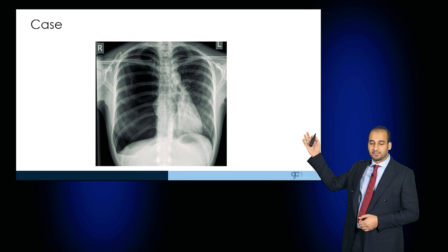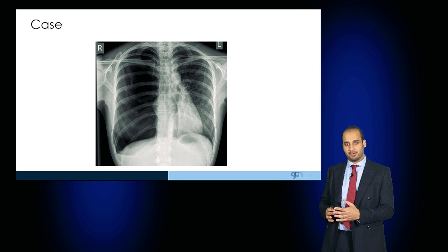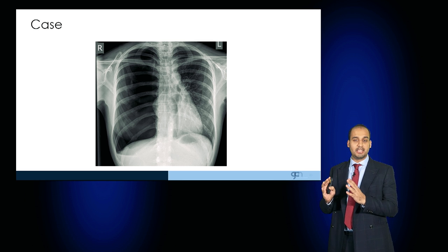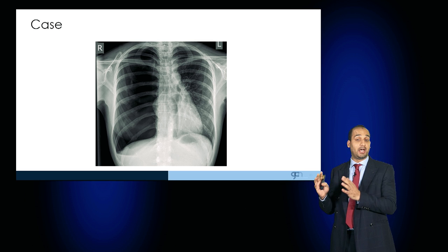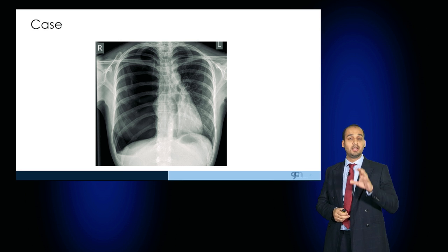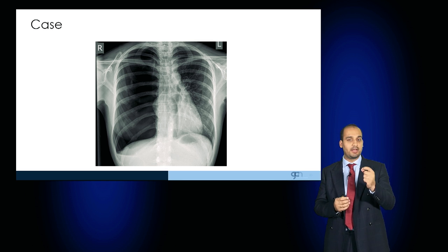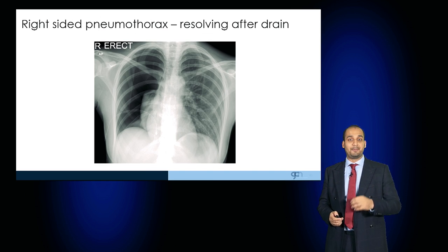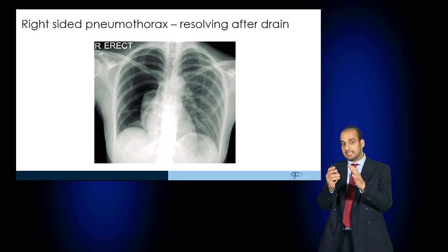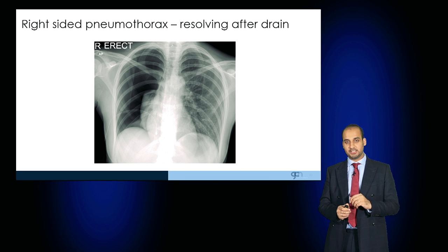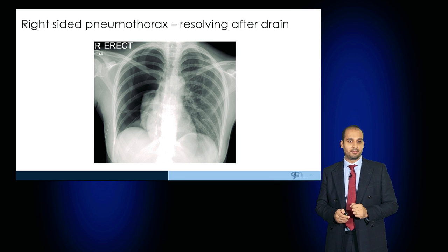This next case demonstrates a large right-sided tension pneumothorax. You can see the displacement of the mediastinum towards the left-hand side — the trachea has shifted, the mediastinum has shifted, and the heart has shifted. A tension pneumothorax is a clinical diagnosis that should have needle decompression as a life-saving measure even before a chest radiograph is taken, so technically a radiograph like this should not really be visible. You can see that a chest drain has been inserted, the tension has now been released, the mediastinum has shifted back into its normal position, and there is very early reinflation of the right lung.